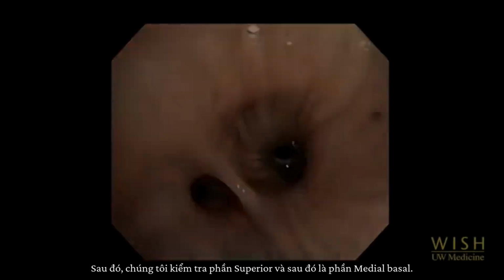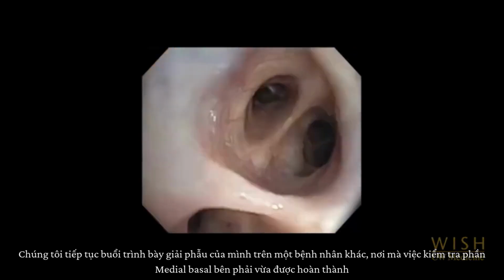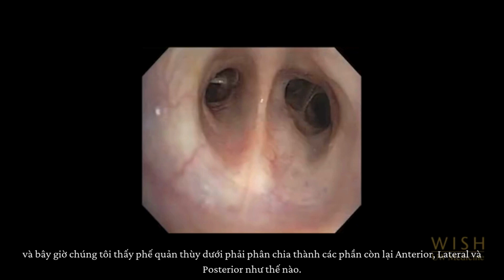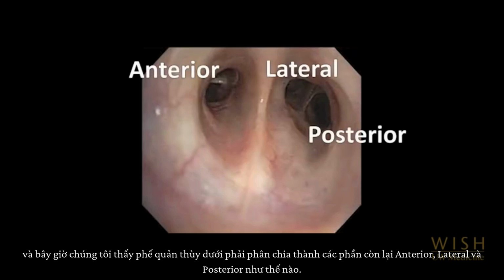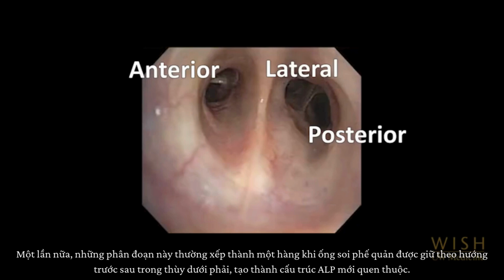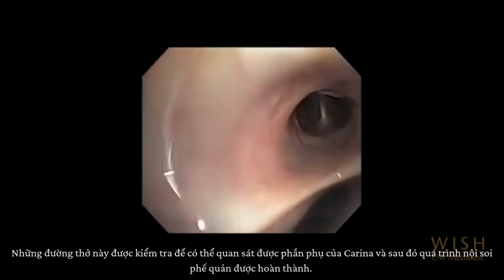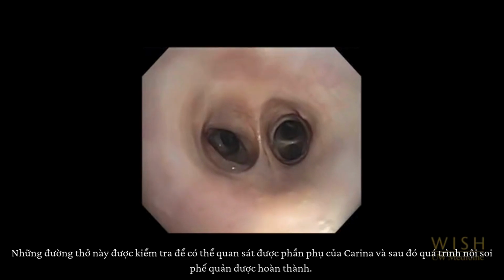We are continuing our anatomy demonstration in a different patient, where the inspection of the right medial basal segment has just been completed, and now we see how the right lower lobe bronchus then divides into the remaining basilar segmental bronchi: anterior, lateral, and posterior. Again, these are typically in a row when the bronchoscope is held in an anterior-posterior orientation within the right lower lobe bronchus, forming the familiar ALP mnemonic. These airways are inspected so that the subsegmental carina have been viewed, and then the bronchoscopy is complete.